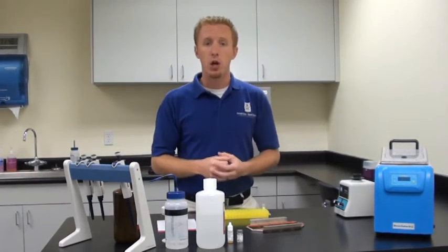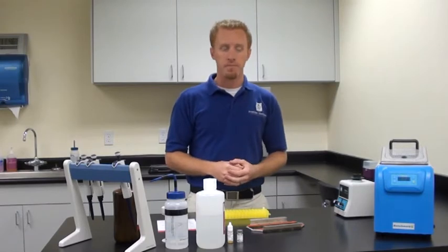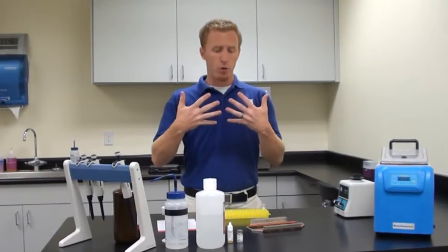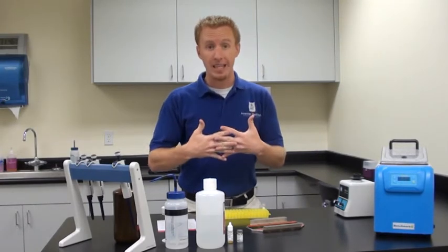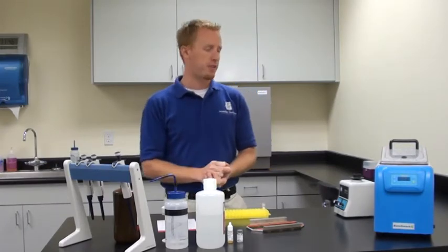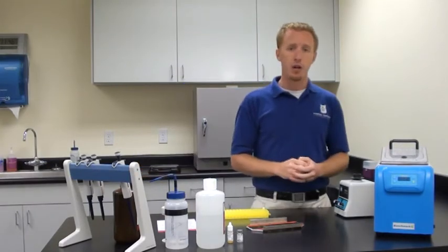It's extremely important that the probe stay intact and moist through the entire hour in order to have successful results. If you are going to use an oven, we would recommend a digital oven. Usually they do hold temperature better than an analog oven. That 62 degrees is critical because we're able to hybridize in such a short amount of time due to the length of our DNA probes.